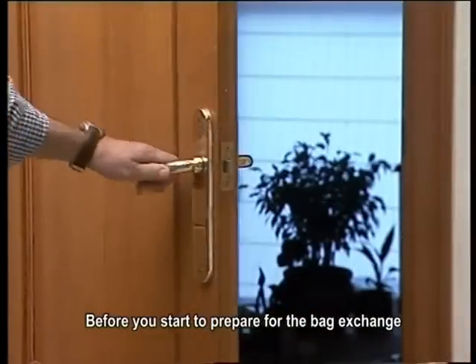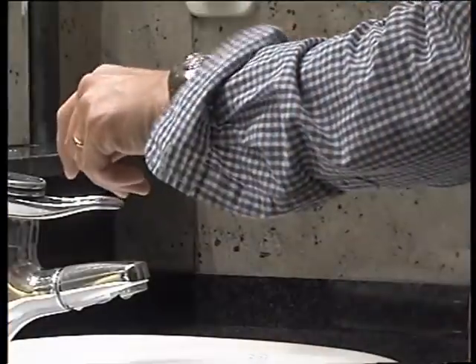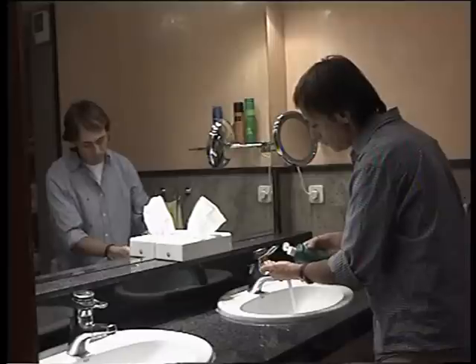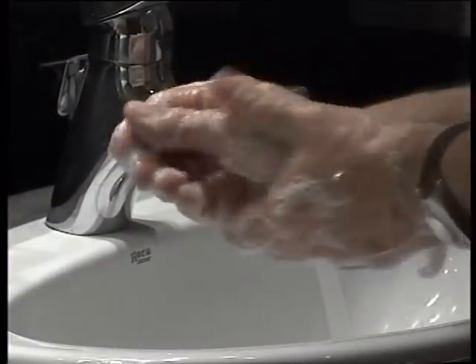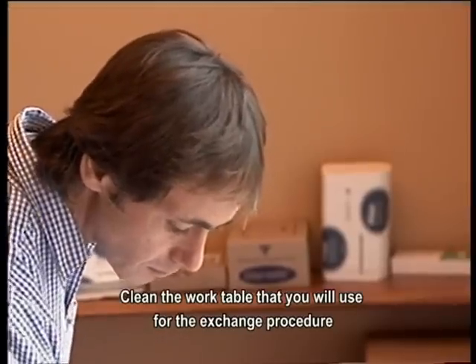Before you start to prepare for the bag exchange, close the doors, windows, turn off air conditioning or fan to prevent drafts. Then you'll need to wash your hands using Frecasoft or other recommended antimicrobial liquid soap. Clean the work table that you will use for the exchange procedure.